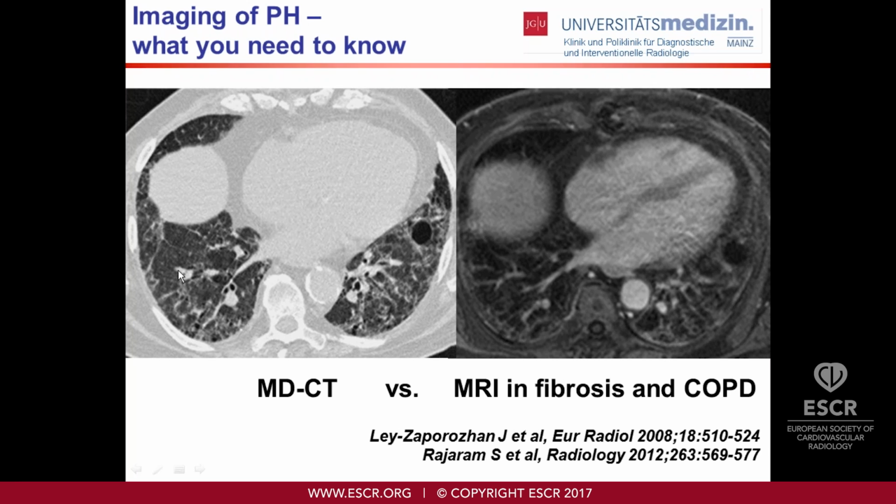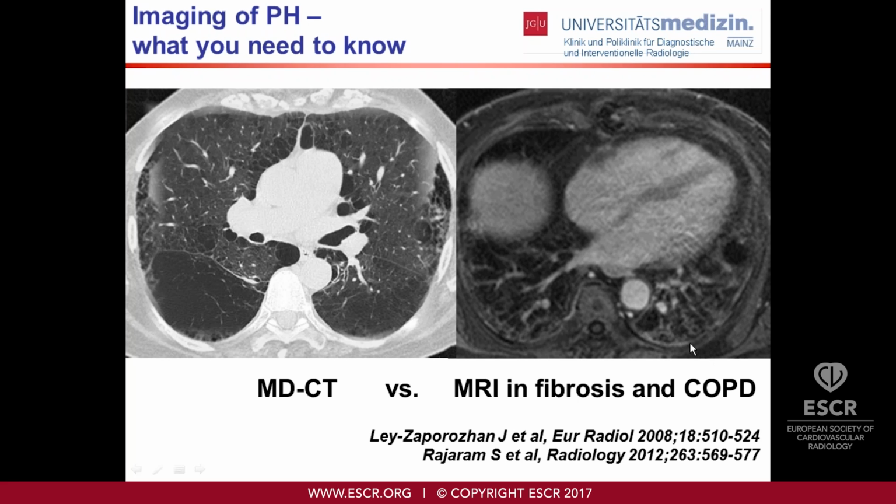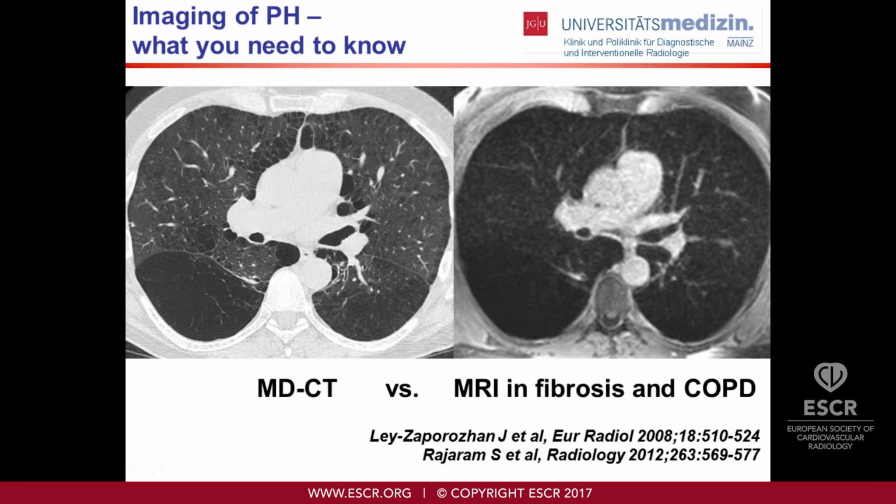And of course both MR and CT allow the assessment of the pulmonary macro and micro circulation, where I think that ECG-gated MD-CTPA is clearly superior to contrast-enhanced MRI, and perfusion imaging is possible by both imaging modalities. I'm going on to this later on.